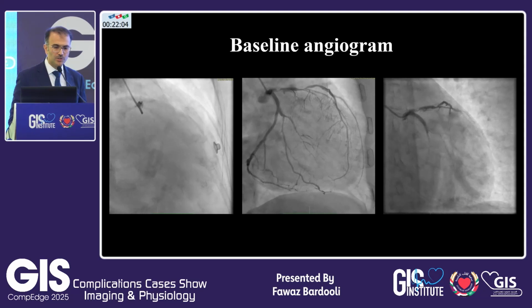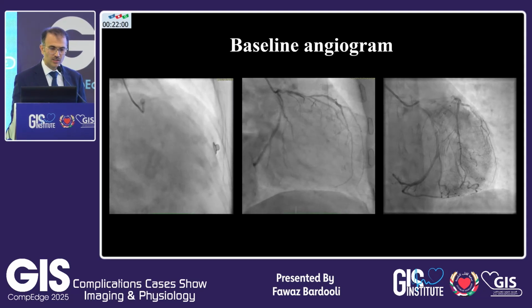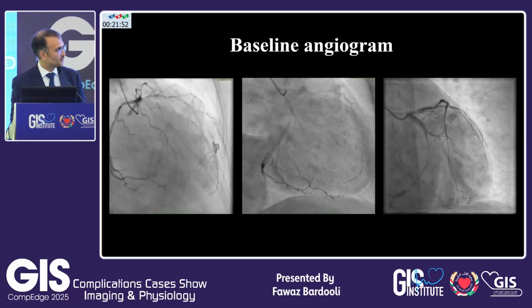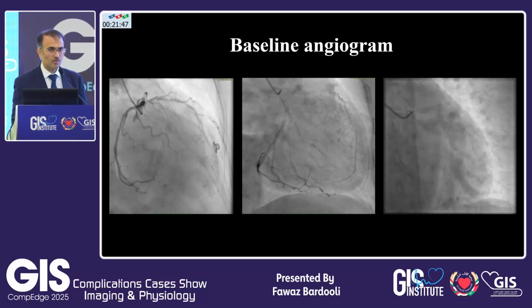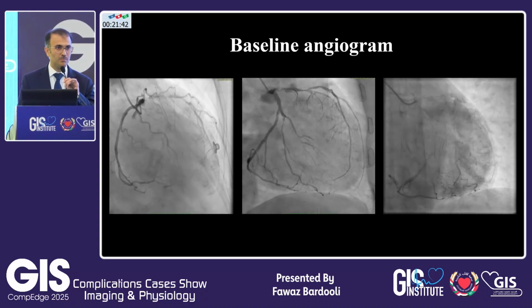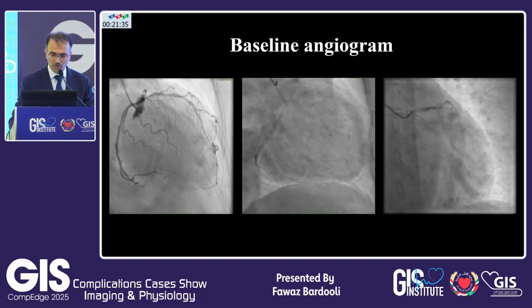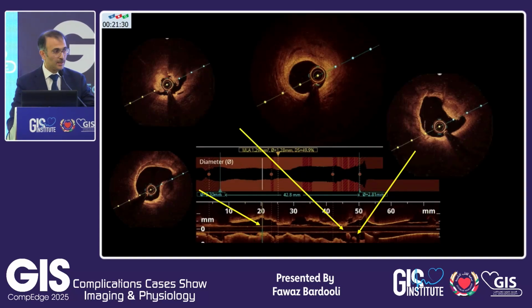Perfect. So if I ask you here, the money is in the LAD, you agree? Sure. Okay, so the question is, do you think that this is going to be a straightforward lesion? Do you need to modify that? No, I think I'll do imaging, and according to the imaging, I will decide my treatment strategy. But we should agree, we are biased because this is an imaging session, but we should agree that some of us would actually just wire, balloon, and stent the lesion. Am I right?